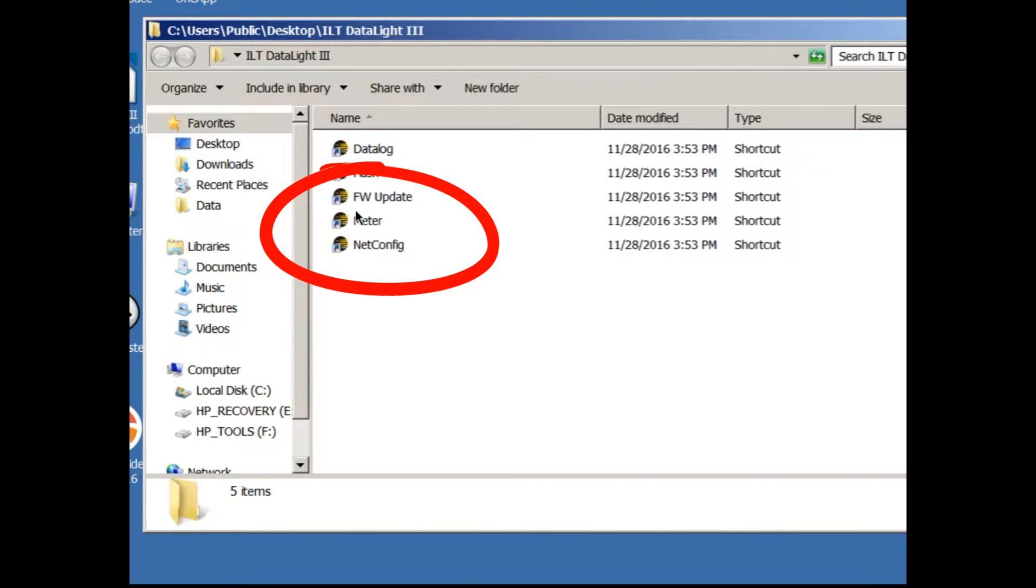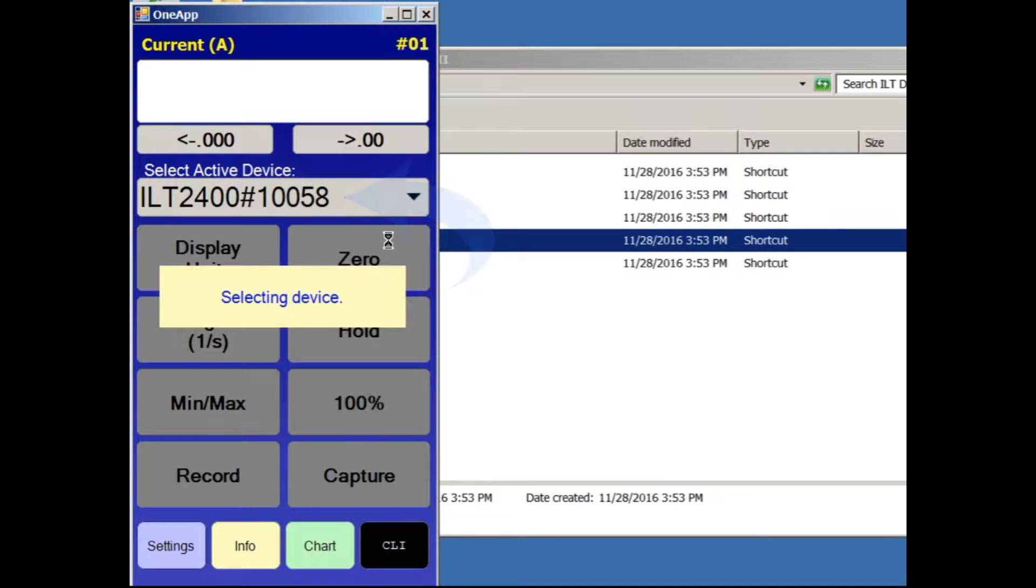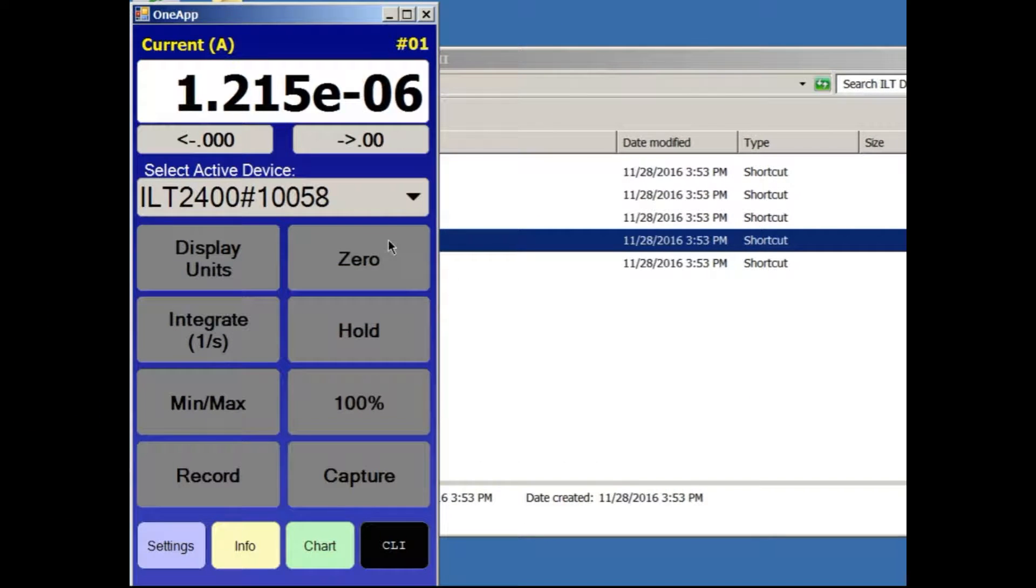Click on the word Meter to open the Meter app. Meter will scan through all of the COM ports and connect with the ILT device.